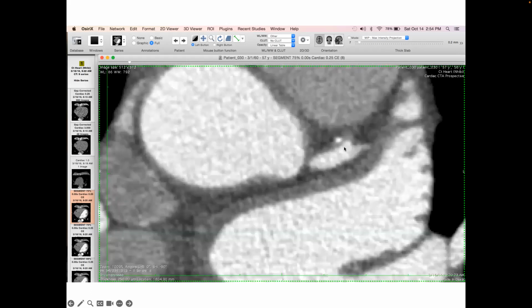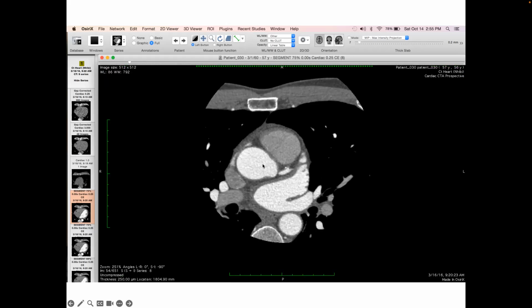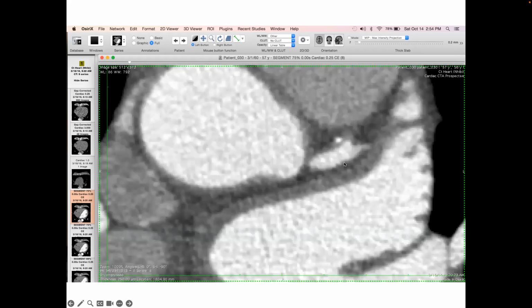If we zoom in and take a look at the central portion of the picture, this little square and that little dot will tell us we're in the right place. When we zoom in, we see high resolution features, but there's an interesting one that probably is not real. If you look at this bright signal there, it looks like a stack of boxes. That's not what's in there. It's not a stack of boxes. It's a continuous function until you get to the quantum domain, and we're never going to get down there.